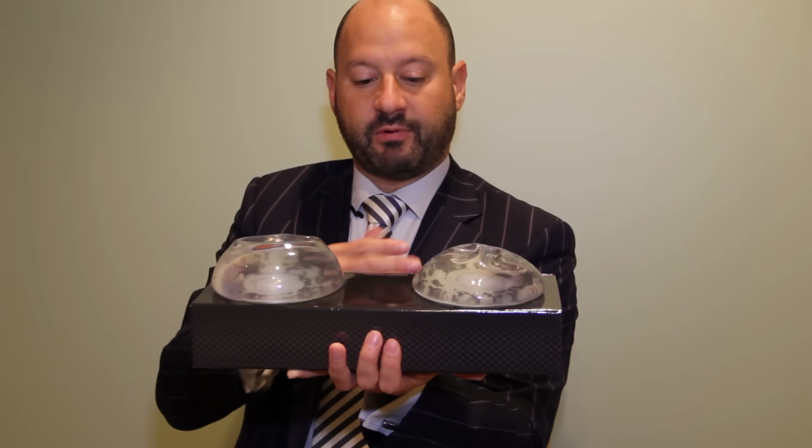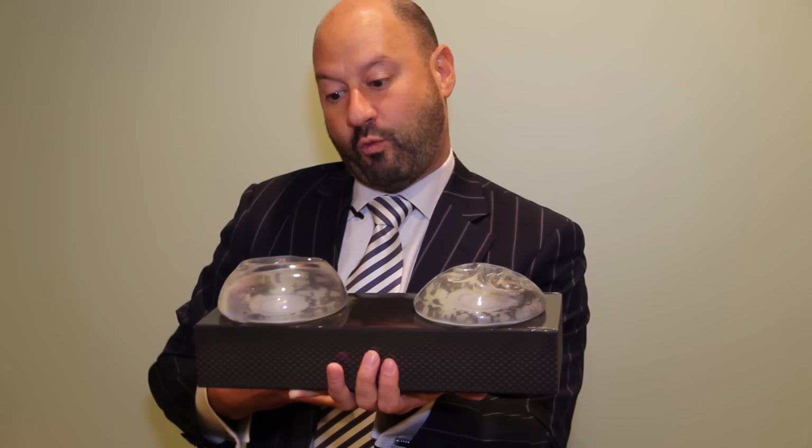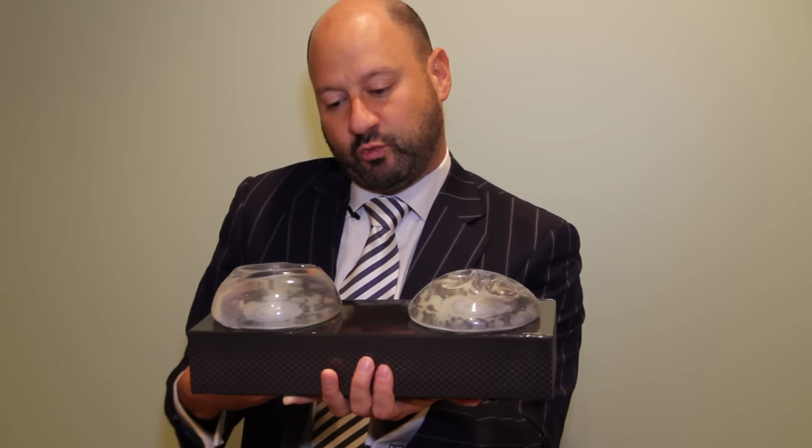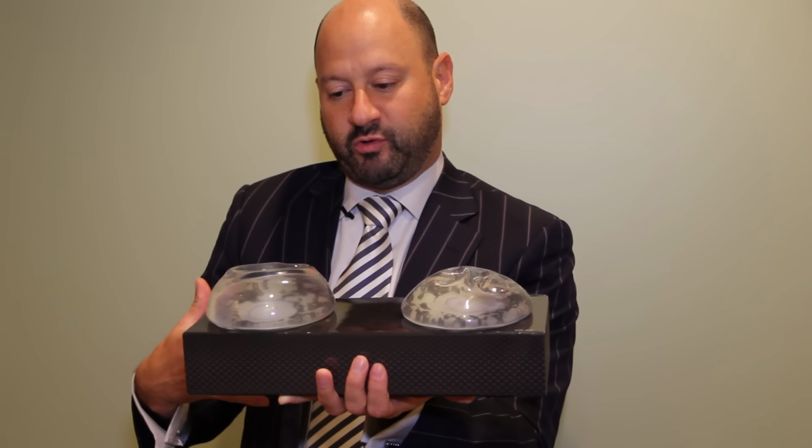So when used properly, we try to get an implant that's about the same width as your natural breast footprint, because that way it doesn't leave a big gap between the breasts. Patients don't like a big gap between the breasts. So by finding an implant that's about that wide, we can determine which ones in that range will fit. That way you can figure out what size you want the breast to be overall, where the high profile would make it a larger breast with the right width.